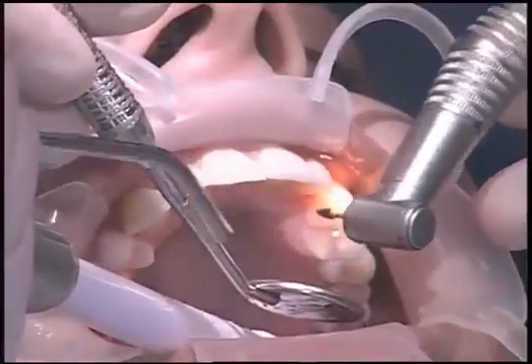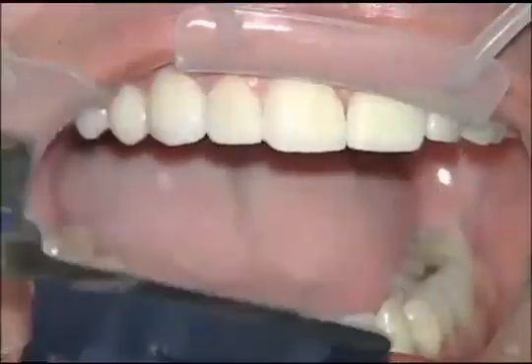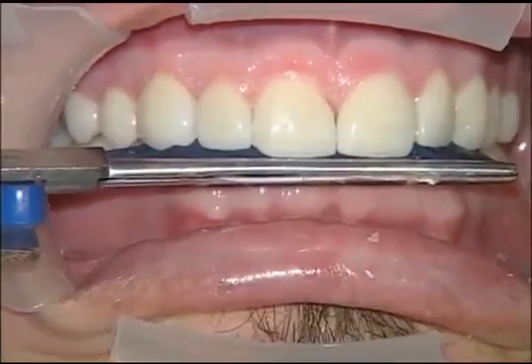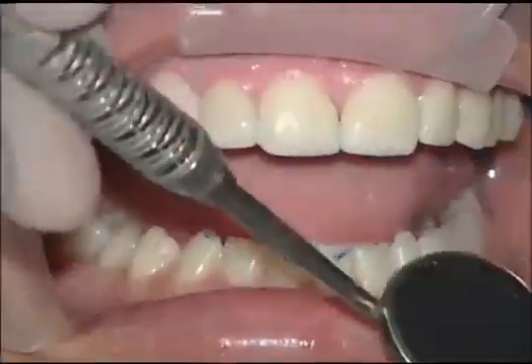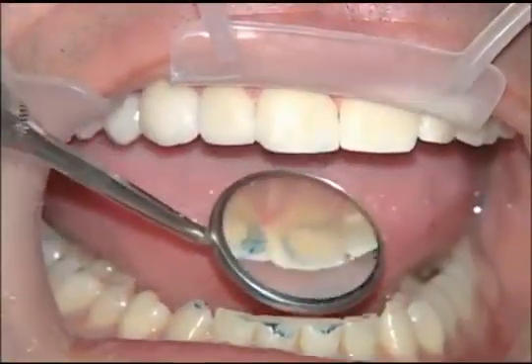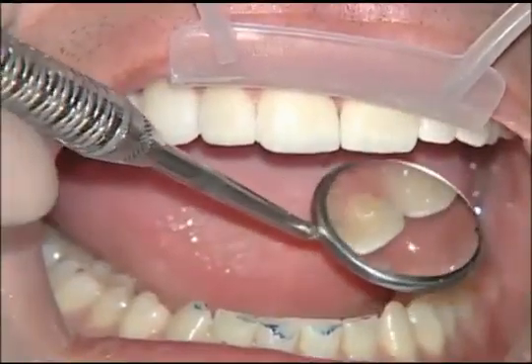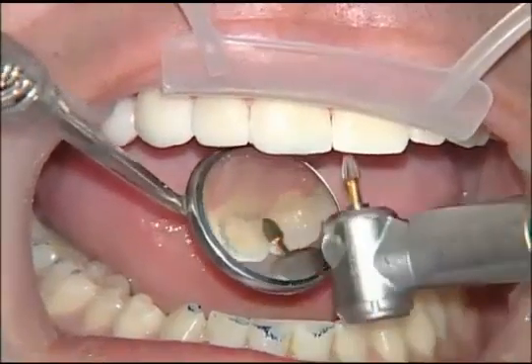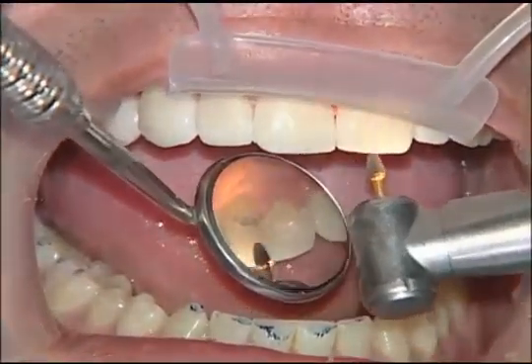When we finish smoothing everything off on the lingual, the next step is to use our articulating paper to go in and see if we have any prematurities. And if we do have any prematurities, or actually what happens more commonly is we have some excess cement that's left over. When you use a translucent resin cement, oftentimes you'll have excess resin cement that you didn't see on a tooth, and that ends up being your high spot.